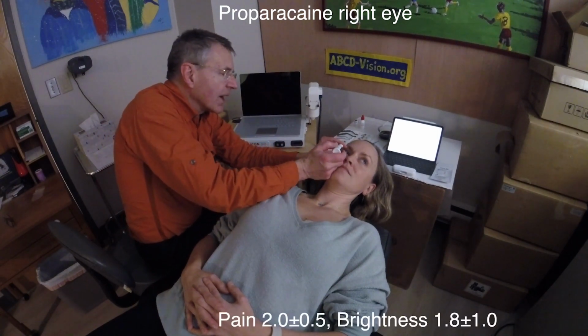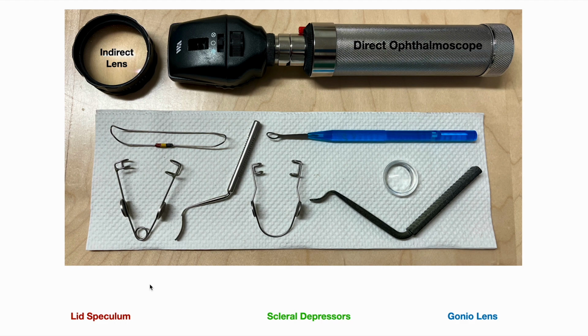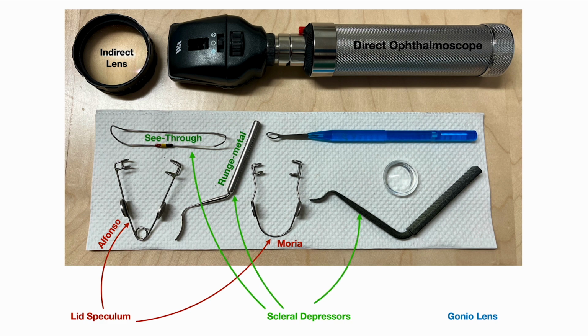Proparacaine in the right eye. Now, when I put it in, look way up high. The instruments for various methods for ROP examination include lid speculum, scleral depressors, and a gonio lens, in addition to the indirect ophthalmoscope and the direct ophthalmoscope.